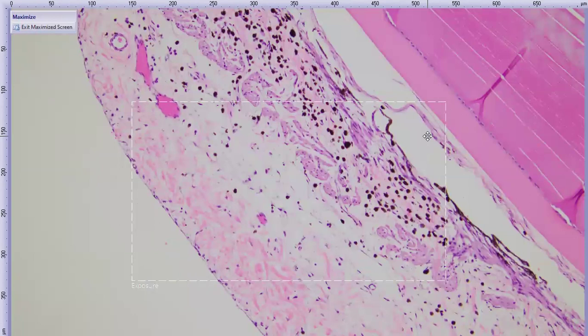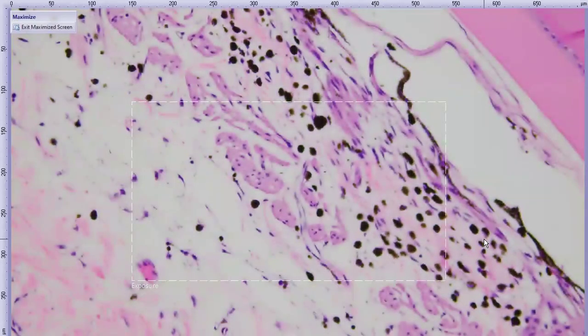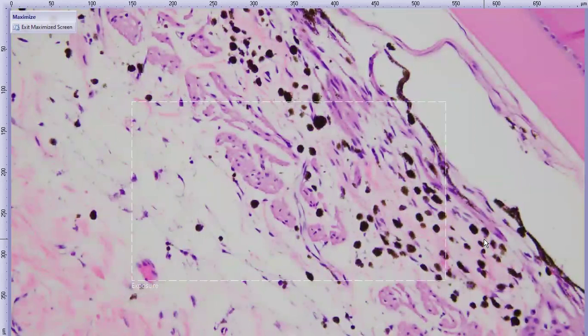So now let's discuss the elephants in the room, now that we've had our tour around this eye and oriented ourselves. There are pigmented cells in the iris stroma of this blue iris leaflet, which maybe you can kind of have like a green iris sometimes, and maybe there's a couple of cells, but these guys are actually round and laden with melanin. And so these guys are actually more likely melanin-laden macrophages rather than stromal melanocytes, and that's interesting.